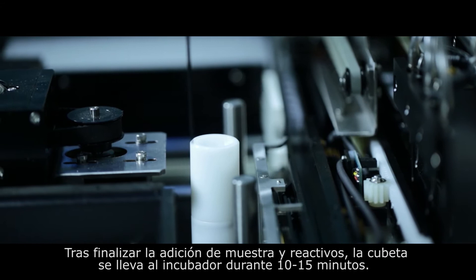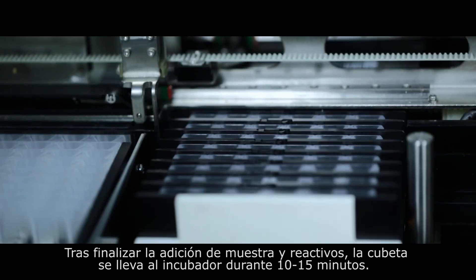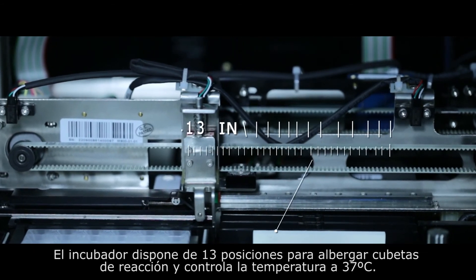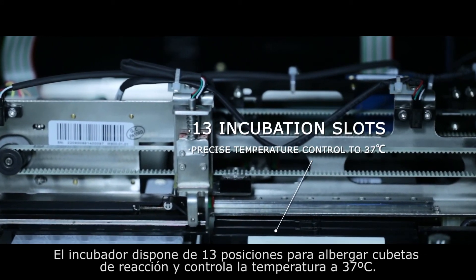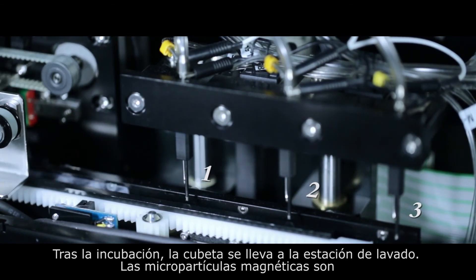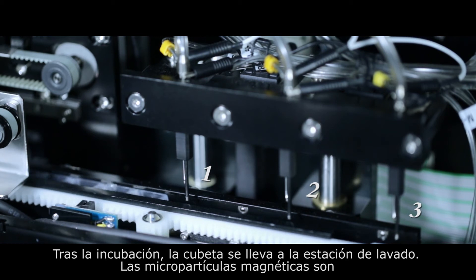After pipetting is complete, the cuvette is transferred to the incubator for 10 to 15 minutes. The incubator has 13 incubation slots available and has precise temperature control to 37 degrees centigrade.